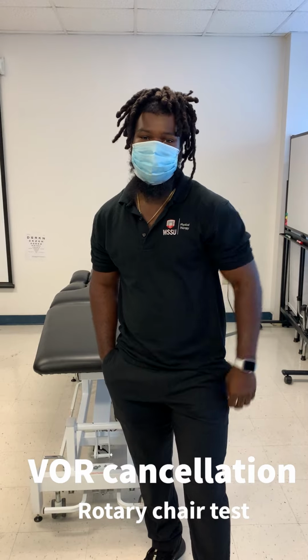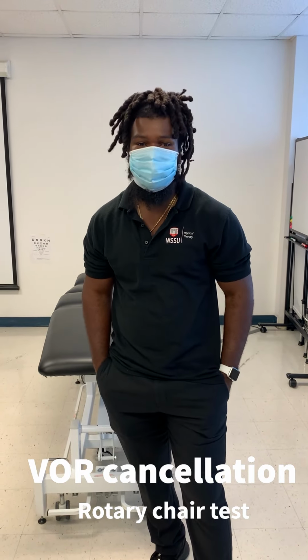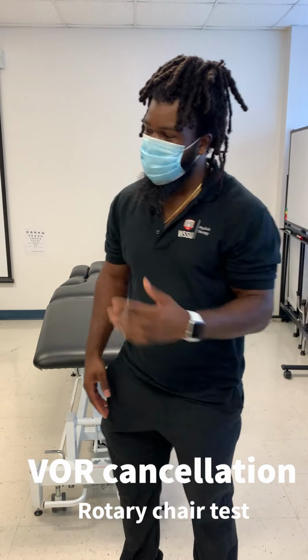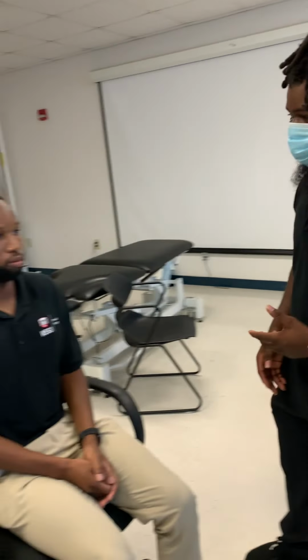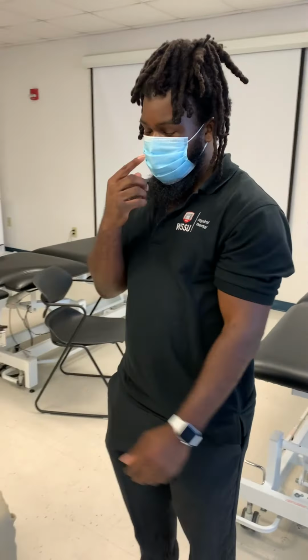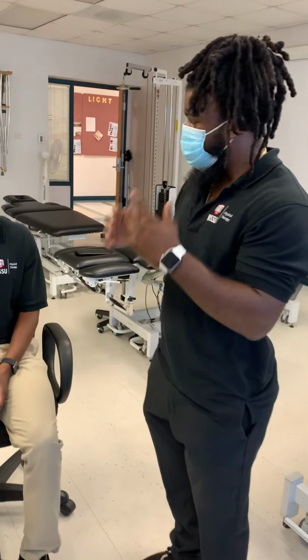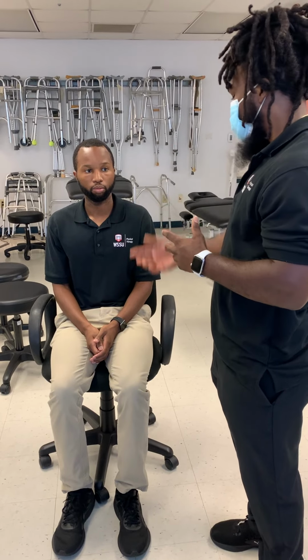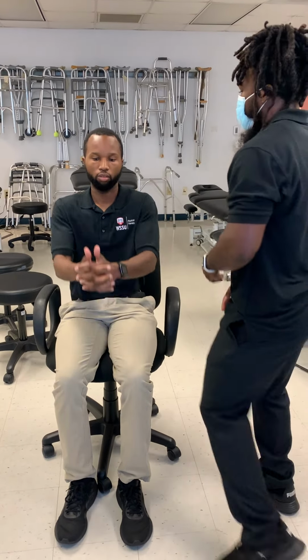So this portion of the oculomotor exam, we'll do a test that cancels out the vestibular ocular reflex. It's known as the rotary chair test. So pretty much, Jacob, what I have you do is I'll place your head in a certain position. I want you to put your thumbs in front of you. I want you to focus in on your thumbs without moving your head, and stay focused on your thumbs.